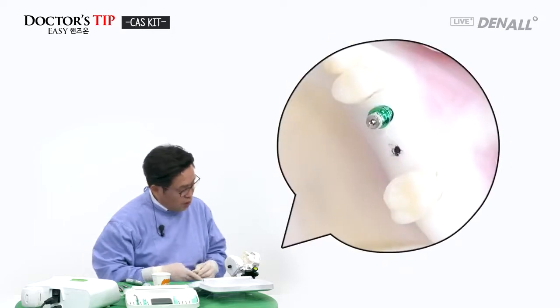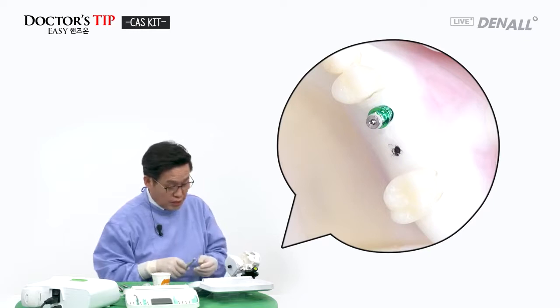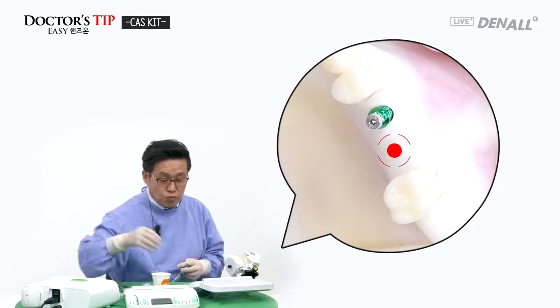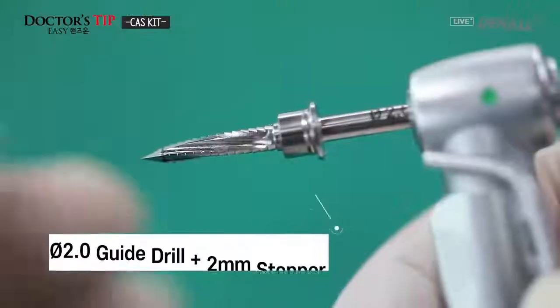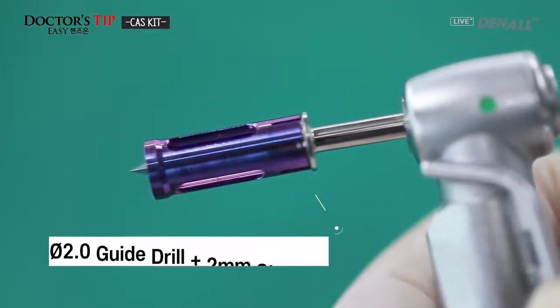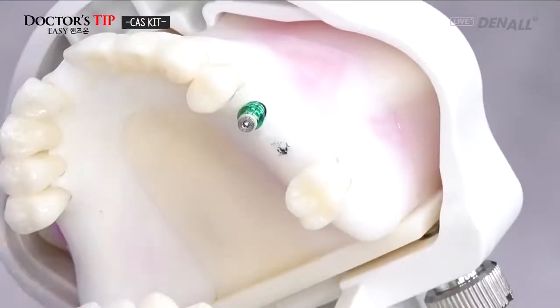Two implants will be placed. And for hydraulic lift, if we make two holes together, water leak can occur. So it is inserted before number 26 drilling is done. The 2.0 drill, the guide drill, will mark the placement location. A 2 millimeter stopper is inserted, connected. The drill is made.